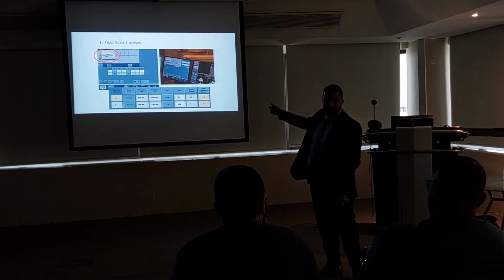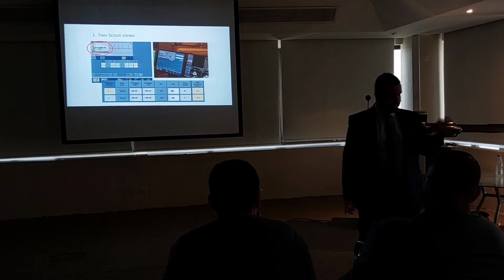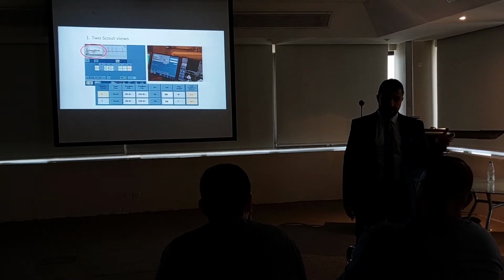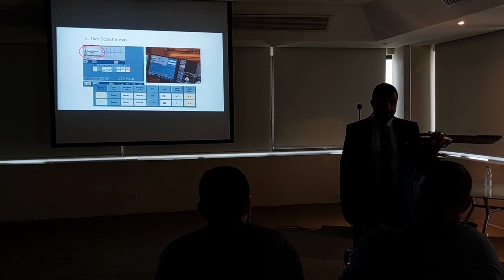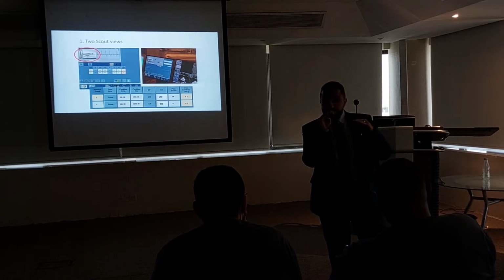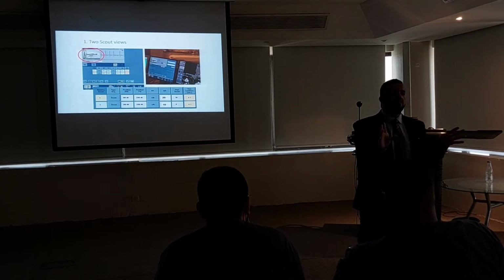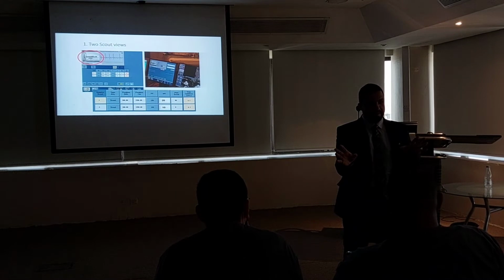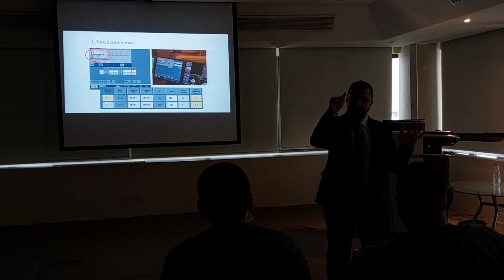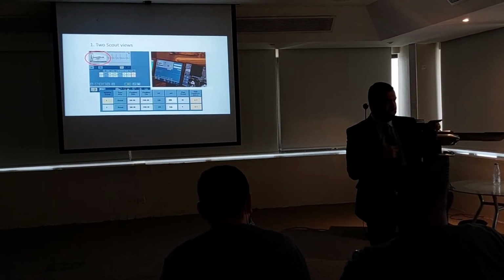I will apply automatic voice instructions, but I will apply a delay after. So the system will say: take a breath and hold. This is good because it's clear voice instructions, the same voice the patient is hearing. That's really better for the patient. And I will not expose, even the scout. It will wait. I will program the protocol to hold for like 5, 6, maximum 7 seconds. After the voice tells him, take a breath, hold your breath, do not scan, it will show you the countdown. 6, 5, 4. This is the time I am monitoring the heart rate of the patient.